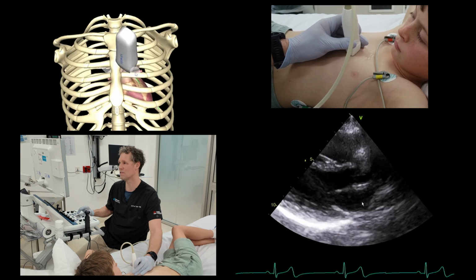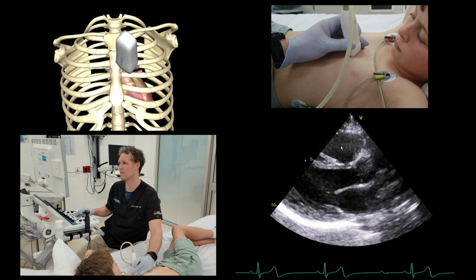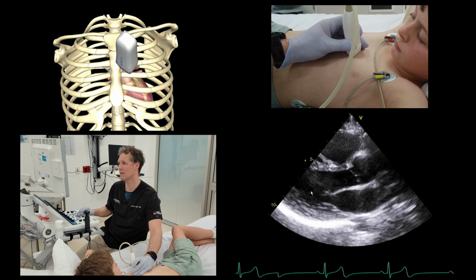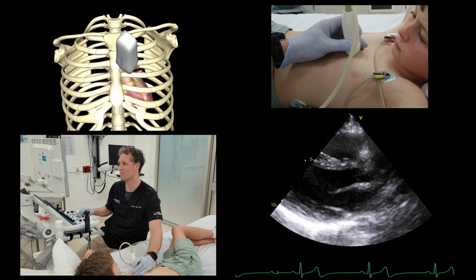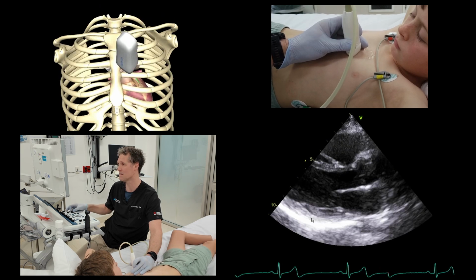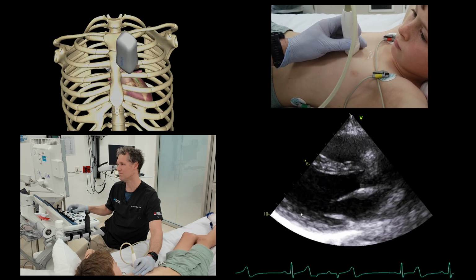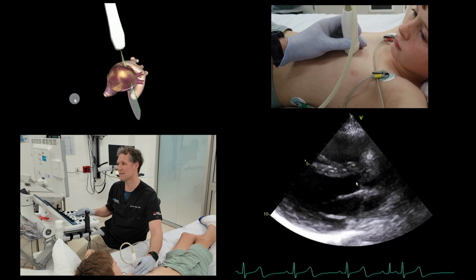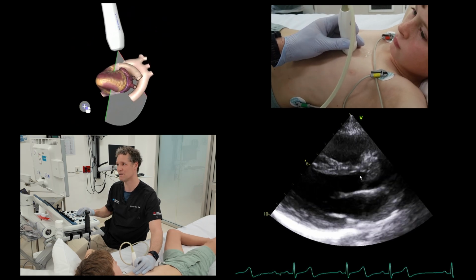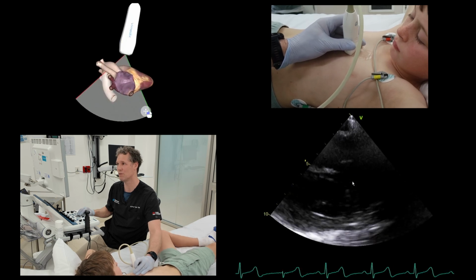So the view that we're after looks a little bit like this. Aortic valve, right ventricle, left atrium, with the mitral valve in the middle there. The bright line is the pericardial space. There's the lung behind it if we change our depth. I'm going to use this aortic valve as the fulcrum for this view. I'll often bring it into the middle of my image first of all.